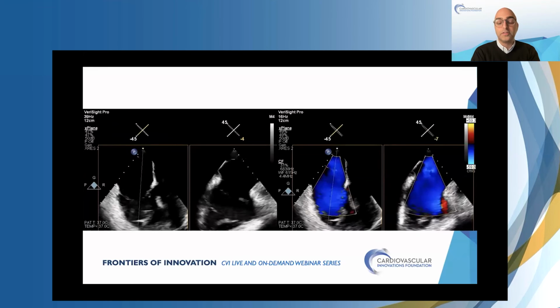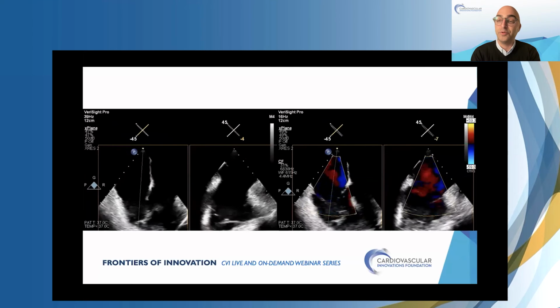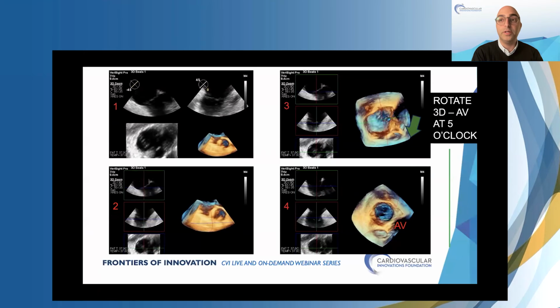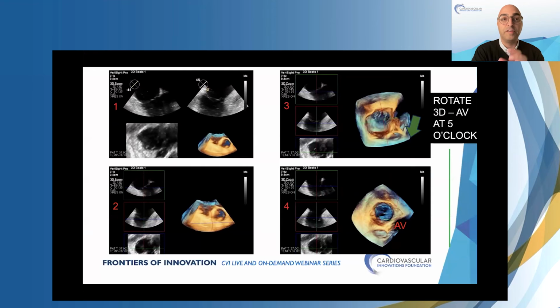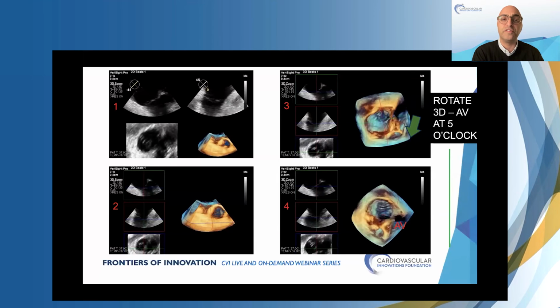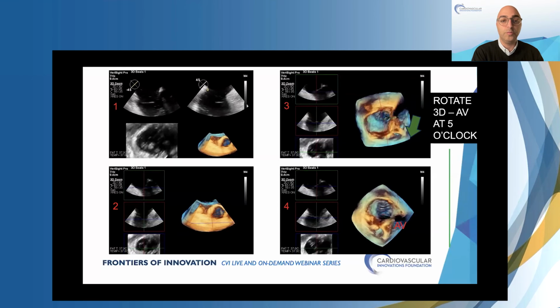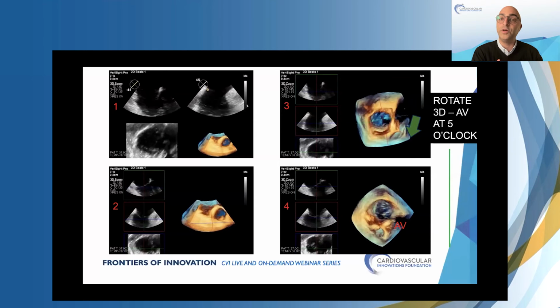Yeah, and I really wanted to use this case, Gagan, because it didn't fall into a traditional 3D navigation grasp at 45 degrees. So here's the sequence we used. In the left upper image, we obtained a 3D zoomed volume at -45, 45. We initially get this left upper image, the first clip. At that point, I'll click multi-view on our panel, and I'll switch to the waterfall layout. So we switch this number 2 clip. At this point, the 3D volume is not pointed towards us, so I grab the wheel and I move it towards me. And as I do that, now we go to clip 3.